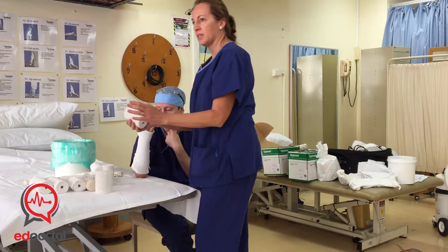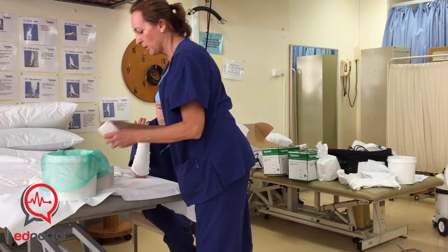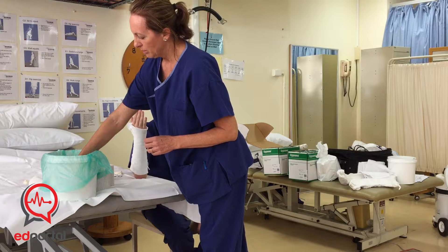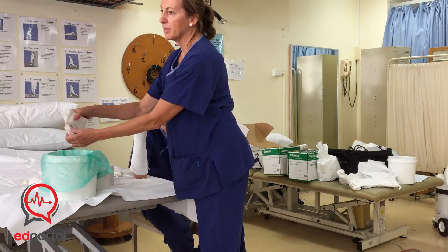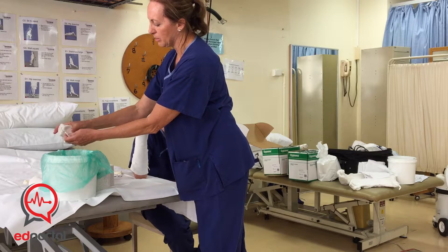Always have your stuff out ready — bucket of water. If the water's cold, you've got a little bit more time to work on it. Dip your plaster in. If you squeeze the top and bottom of it, you leave a fair bit of water in it. If you're comfortable going quickly, you can squeeze a bit more water out.